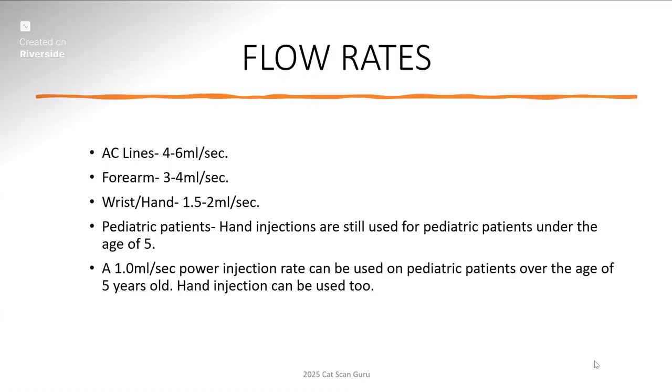In hand injecting, you can just hand inject it, let it all go in, and then hit the button. It's going to be a perfect study. But always follow what your department policy is. These are just some standard things.